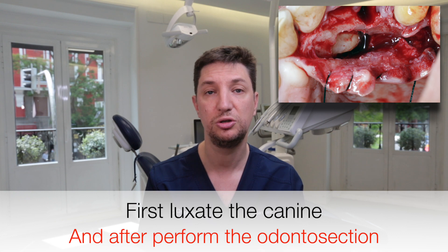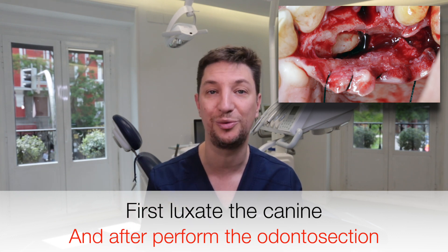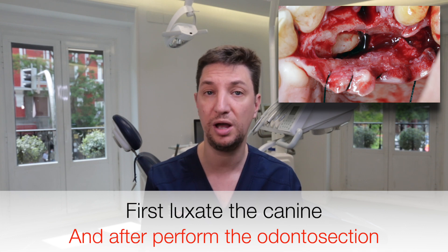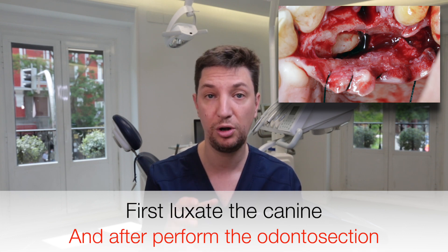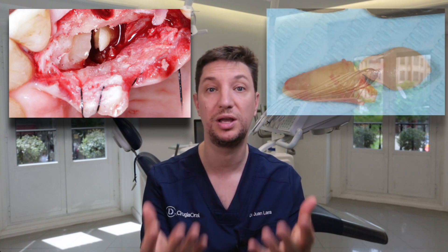Once the crown is exposed, we always luxate the tooth first. Do not perform the odontosection first, because if you do, you will have the entire root unluxated up there and it will be very difficult to remove. So first luxate the tooth, and once it has some movement, then perform the odontosection. We remove the crown, then remove the root — because it's already luxated and moving.